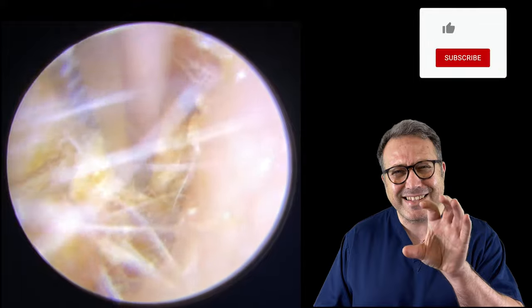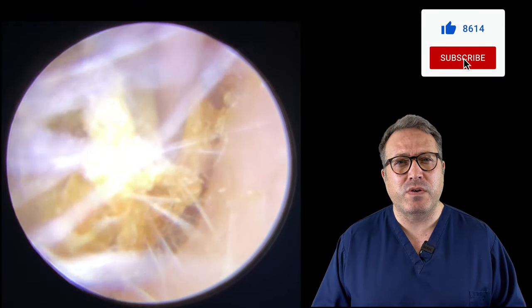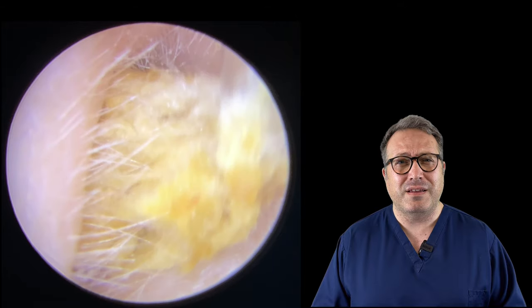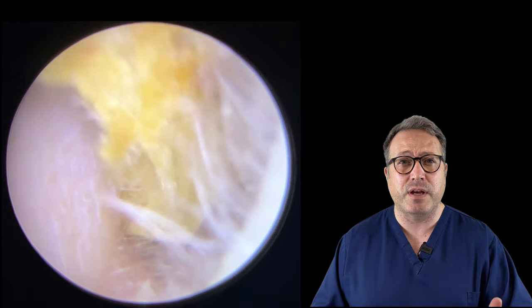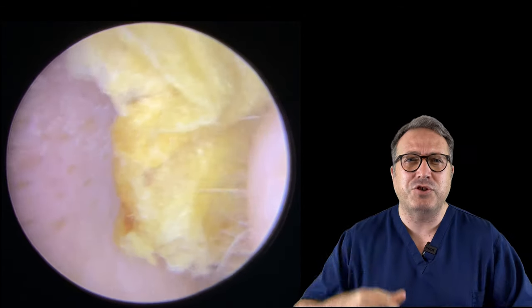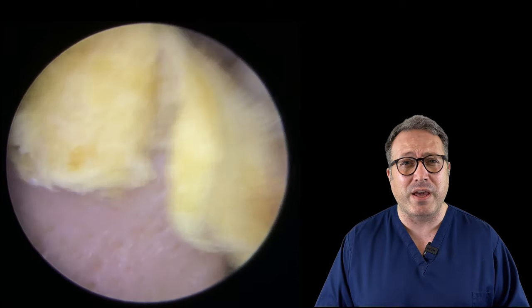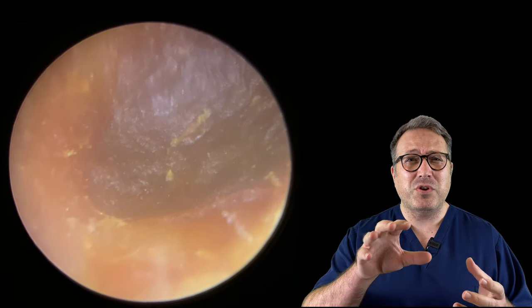Here we are, just getting down on top of it now. As we wiggle this away you'll see just how much the patient has popped in there. As we get a grip, we're going to slowly - you've got to be really careful when taking away these tissue paper type substances from the ear canal because it can split the tissue paper as you're bringing it out. You can see just how much was still in there and just how much of that was coming away. It was quite a large wedge.